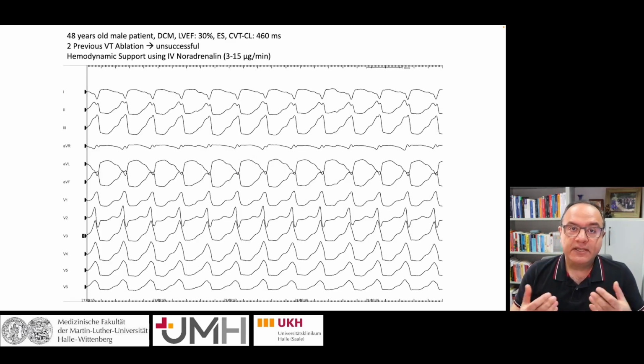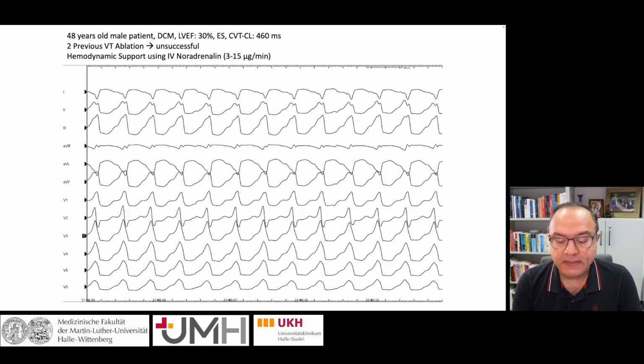Our first patient is a 48-year-old man with non-ischemic cardiomyopathy, low ejection fraction, LV ejection fraction 30%, electrical storm, and VT cycle length 460 milliseconds. Two previous ablations were unsuccessful.